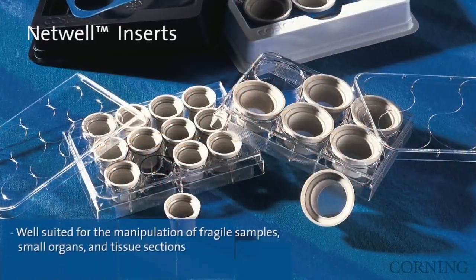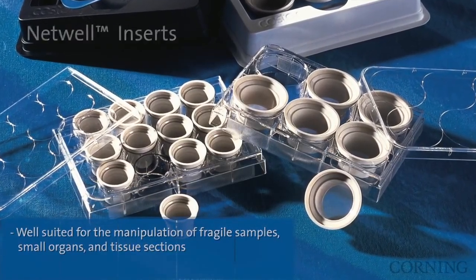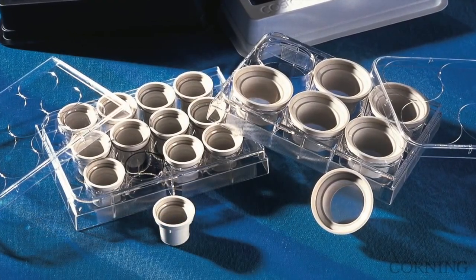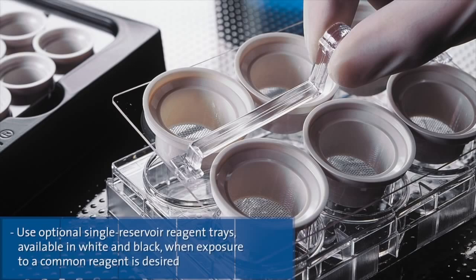In addition to the full line of microporous membranes, Corning also offers Netwell polystyrene inserts fitted with polyester mesh bottoms that function as tissue carriers and strainers. Inserts are available sterile in two mesh sizes, 74 micron and 440 micron, pre-loaded in 6 or 12 well cluster plates with lids. Specially designed trays and carriers are also available.